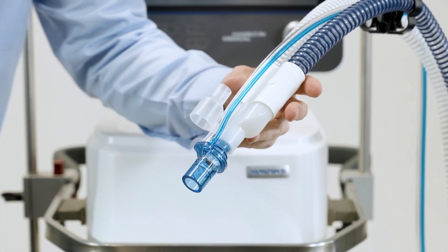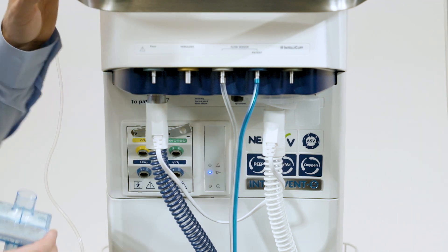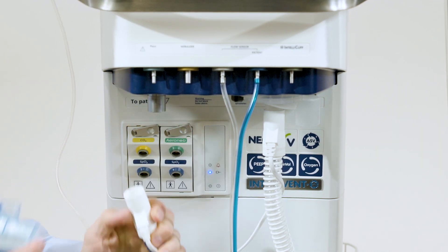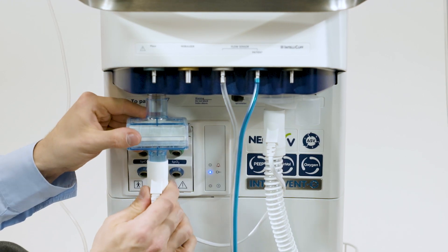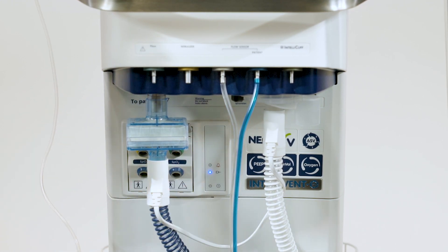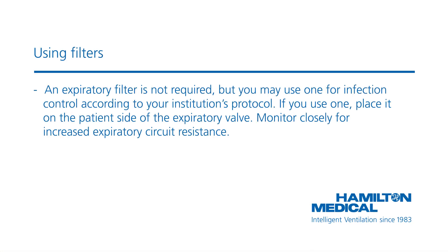To prevent patient or ventilator contamination, connect a bacterial and viral inspiratory filter between the patient and the inspiratory port. An expiratory filter is not required, but you may use one for infection control according to your institution's protocol. If you use one, place it on the patient side of the expiratory valve.